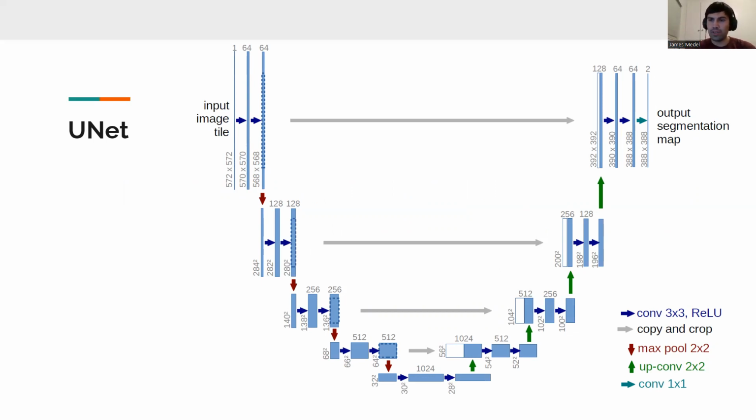And in this case, with convolutions and max pooling, the effort is to extract out the most important features to help us identify, and in the case of UNet, segment the polyp in the image. And then we actually upsample on the right side of the U. And so what that does is, after we've extracted out the insight we needed from the images, now we have to display it in a predicted image. And so that's the segmentation part.